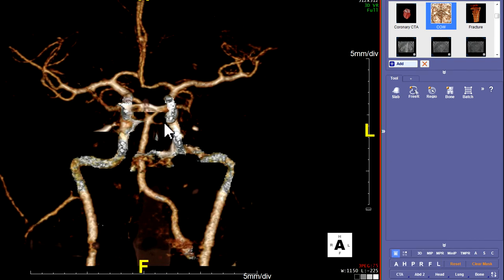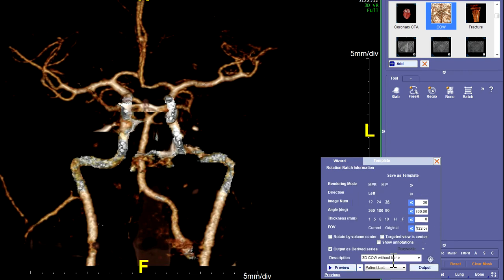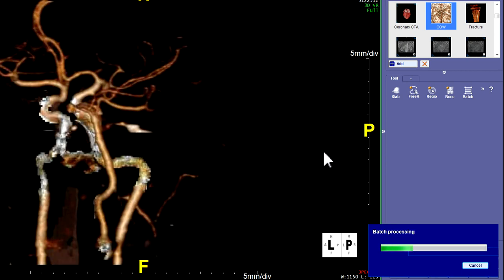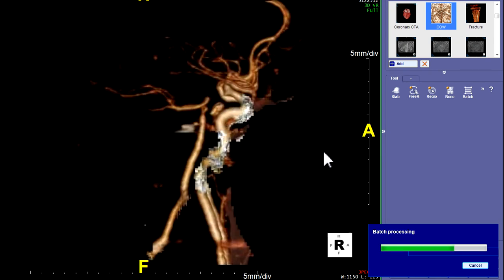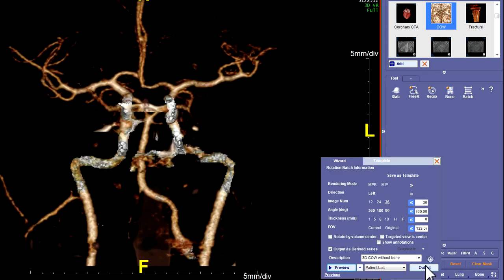Now we're going to spin it the other way. We spun it from superior to inferior; now always start with the anterior view again, and we're going to spin it over towards the right. We'll hit F8 to open it up, hit that radial recon again, and this time we're going to spin it this way. Hit that button — all those things will be saved. Hit the preview and make sure that it's all fitting on the screen, that it's full. That's almost filling the screen, windows are good. Tweak it as needed, and then hit the output to send it to the patient list, and we're done with that.